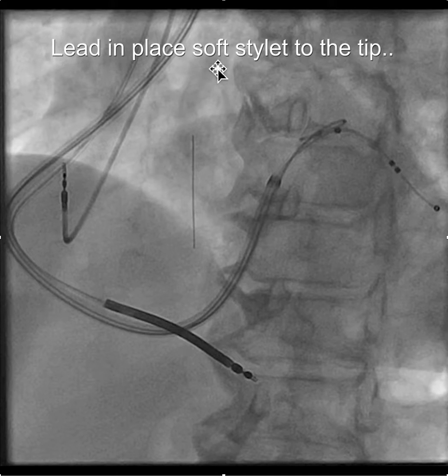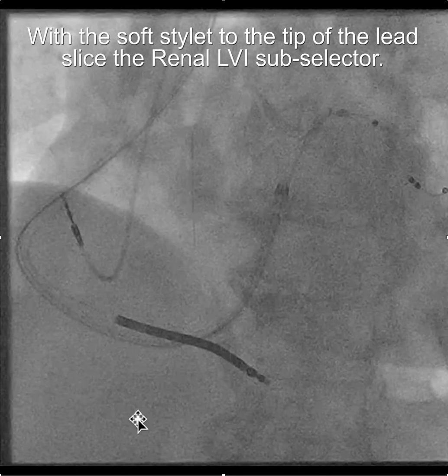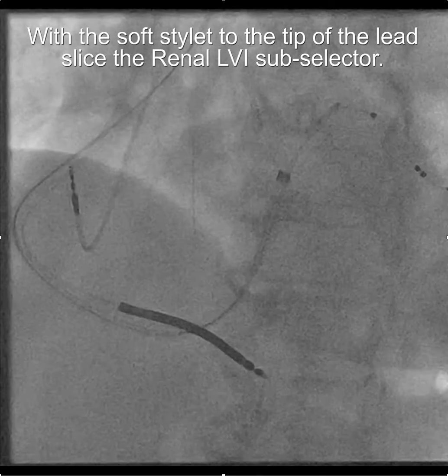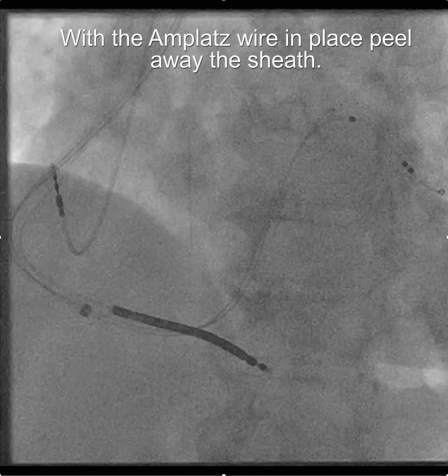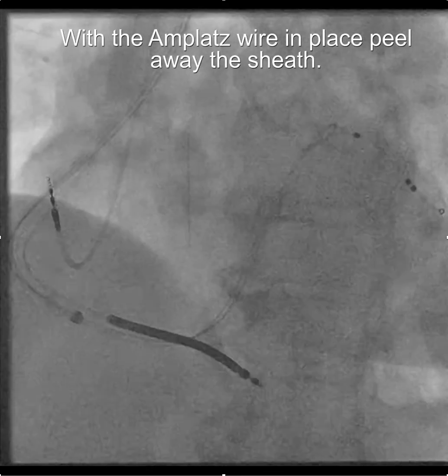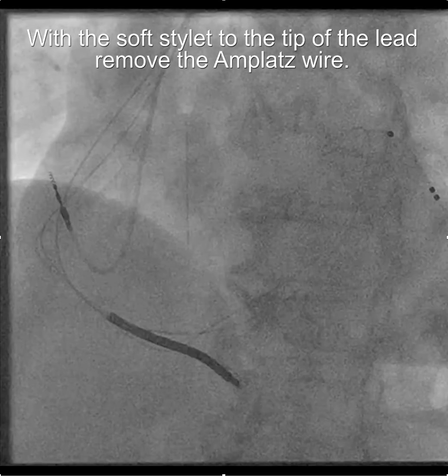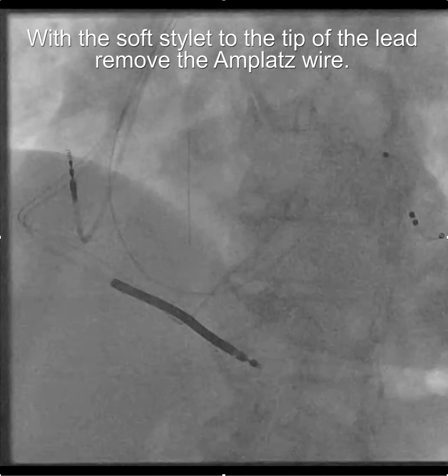Once the lead is in place, put a soft stylet all the way to the tip, which can be done as long as the subselector is in place. You can see the subselector here is in place, the amplatz wire is still in place, and the stylet is to the tip. The first step then is to cut away the subselector. Then, with the amplatz wire still in place, withdraw and peel away the sheath. Then, with the soft stylet still to the tip of the pacing lead, remove the amplatz wire.